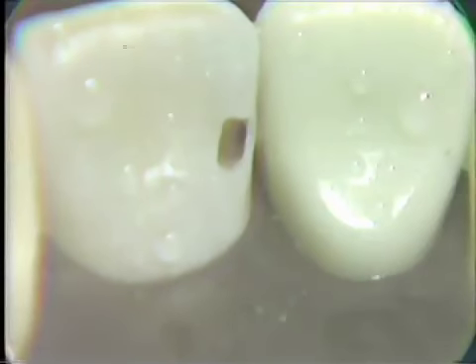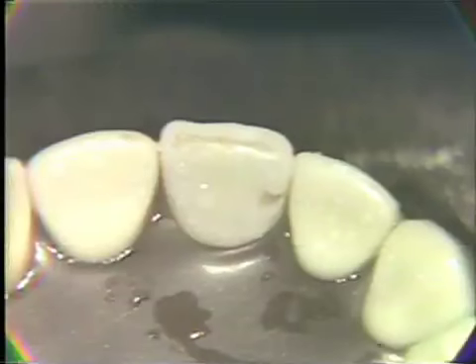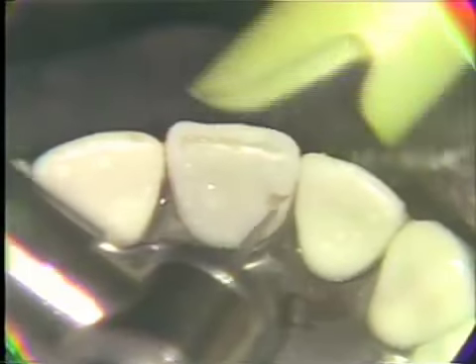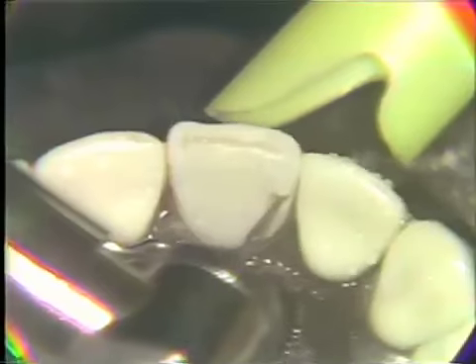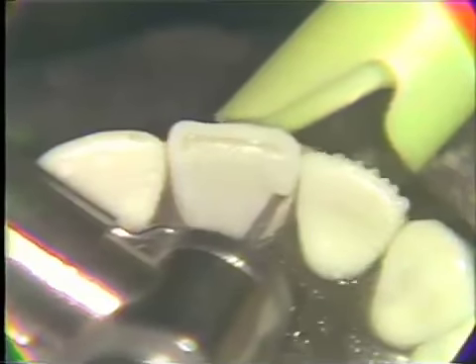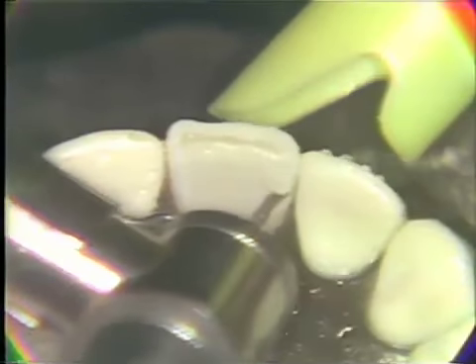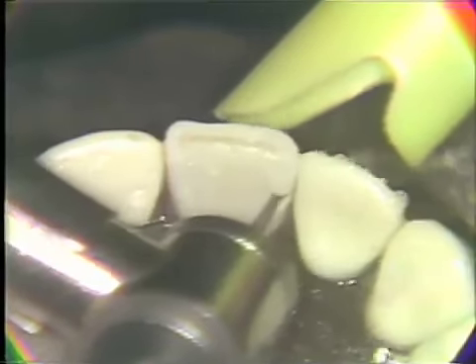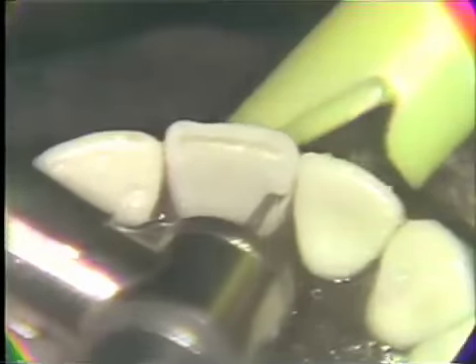The entrance to the preparation, we can now change burrs and move on over to a 169 burr. With the 169 burr in the contra-angle, we're ready to carry out the further extension of the preparation. Again, letting that labial cervical aspect be at a lower position, more gingival position.